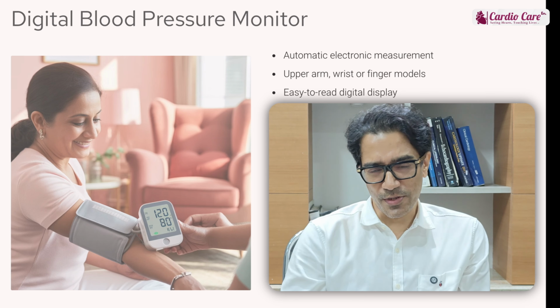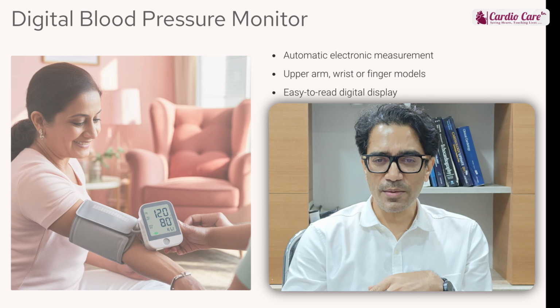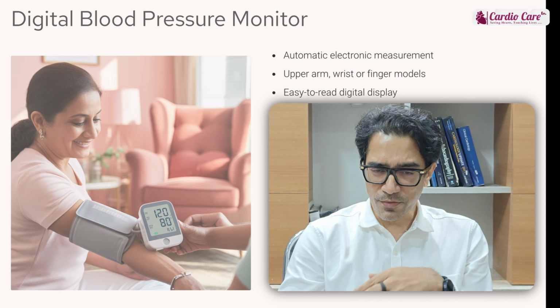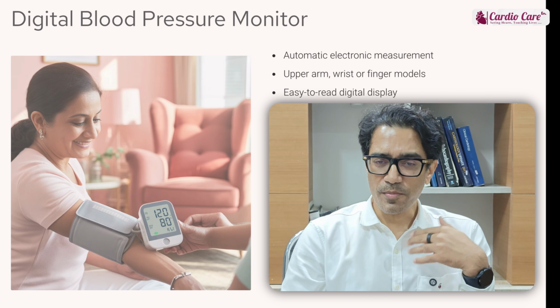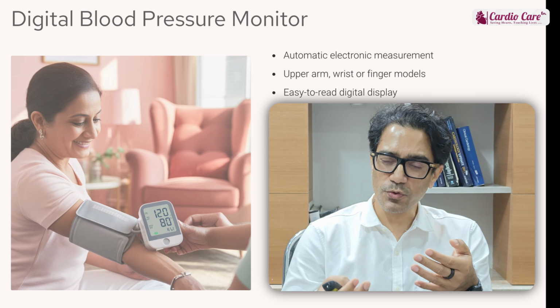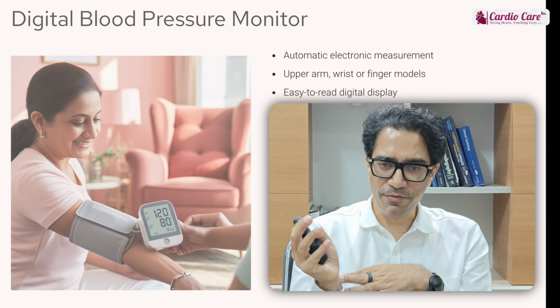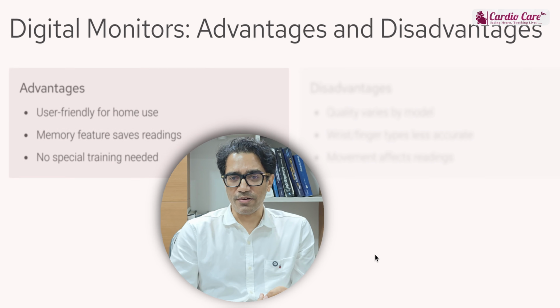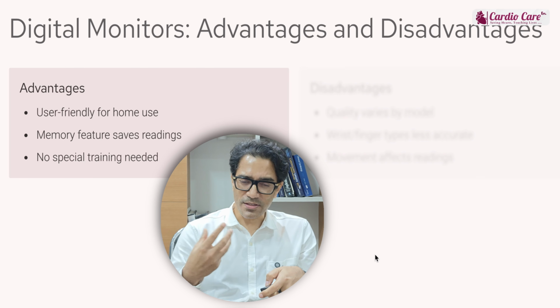There are three types of digital monitors. One you can put on your arm, another is a wrist-based digital monitor, and the third is finger-based. Of these, the arm monitors are the most accurate. So if you want to choose a digital device, it's better to choose one which uses the arm-based method of checking blood pressure rather than a finger-based or wrist-based method. So it is most user-friendly. These are the advantages. And it is not bulky. You can store the readings. These are all the advantages.